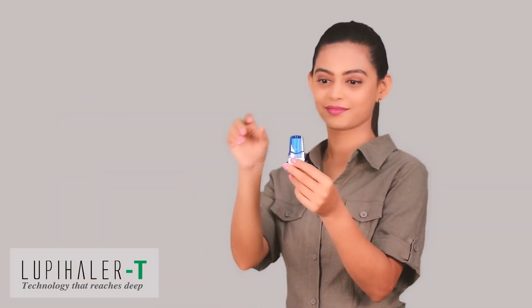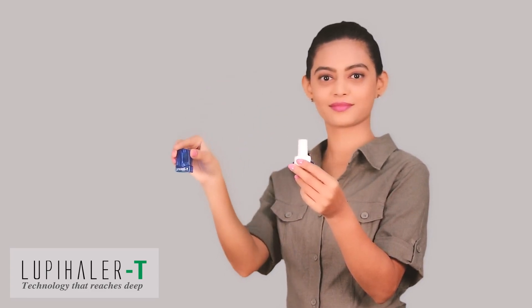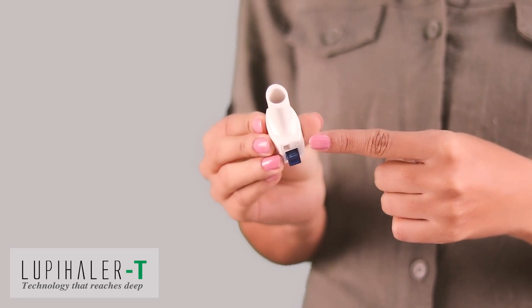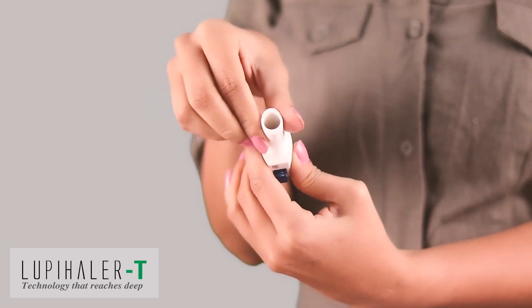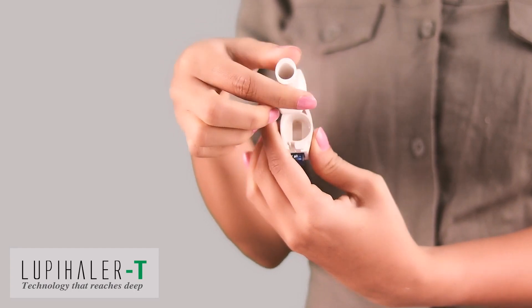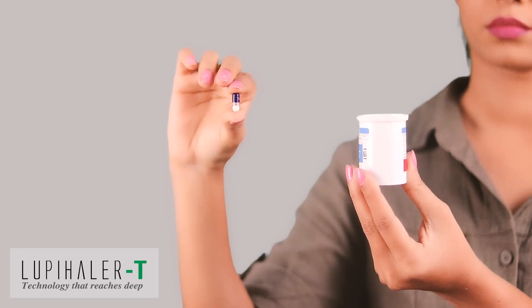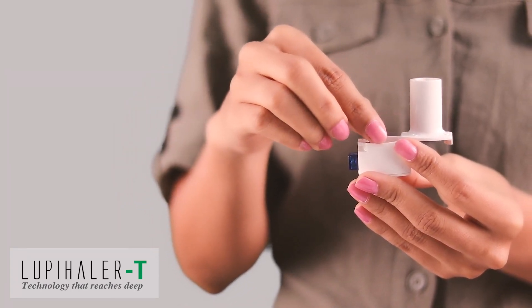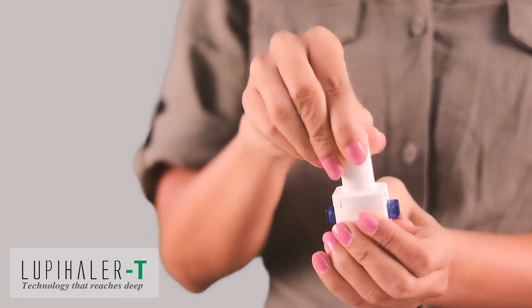Before using Lupehaler T, remove the protective cap. Hold the Lupehaler T tightly in your hand and rotate the mouthpiece in the direction of the arrows. Take a capsule and place it in the capsule chamber as shown. Close the capsule chamber by rotating the mouthpiece in the off direction.